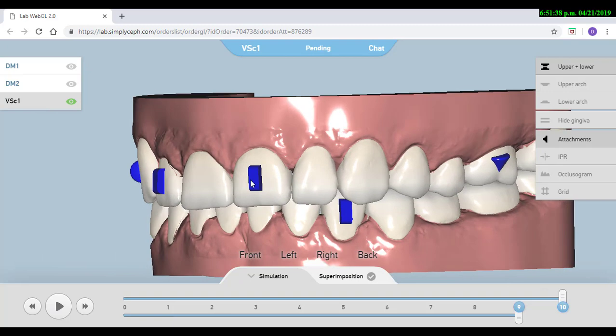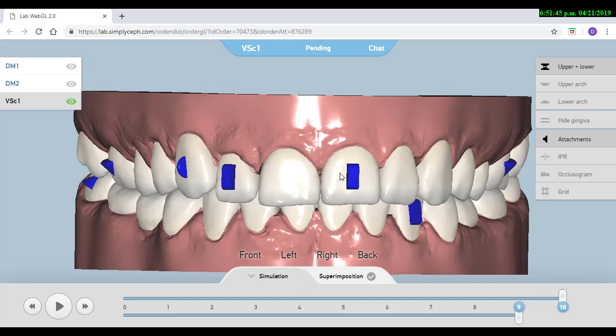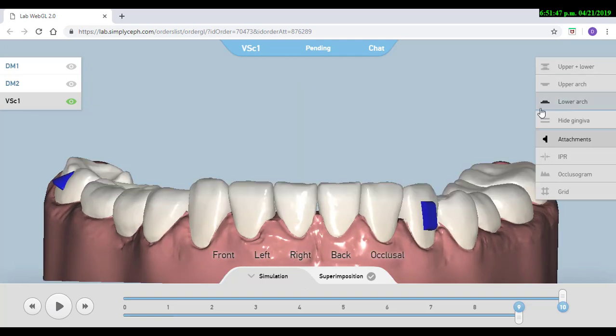But if that upper lip is already covering too much those upper incisors, I don't want to intrude them because that will affect the smile. So in that case I will just focus on making intrusion from that lower canine to the other lower canine.